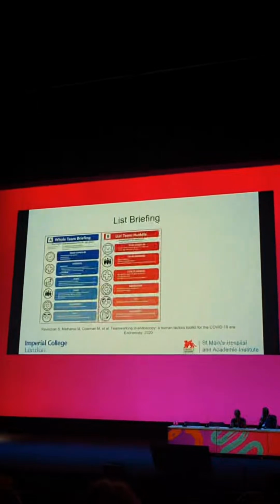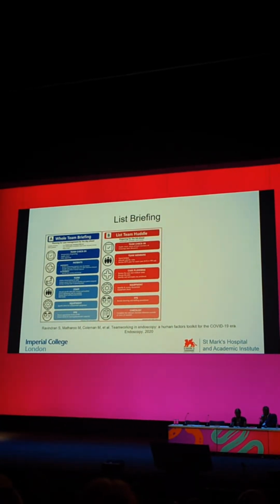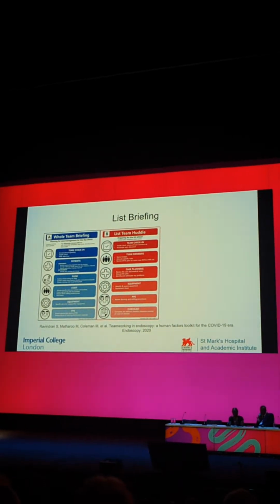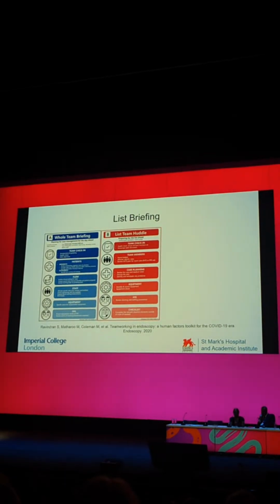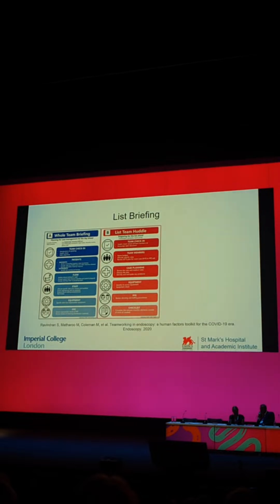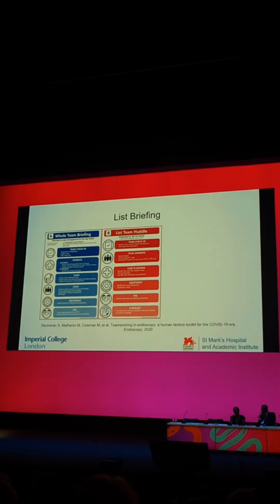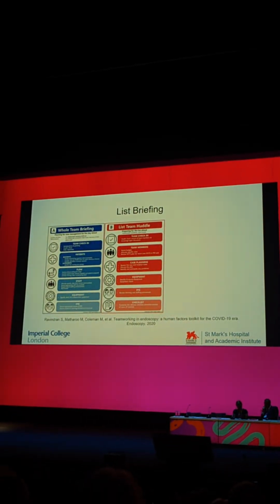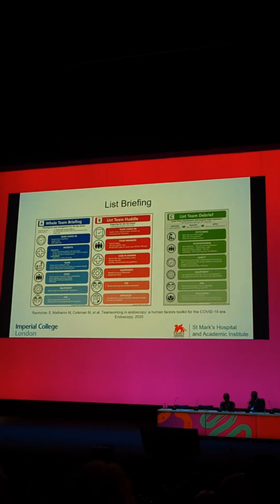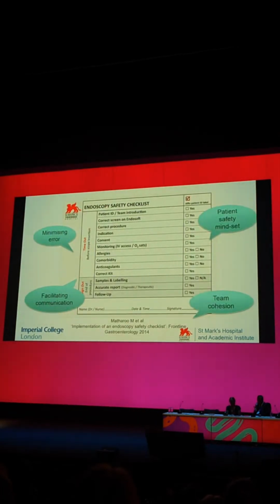You have a whole team huddle at the beginning of the day with your nursing team and your decontamination staff, to see what issues around the unit are. And then you have a team huddle with the people that you're doing the endoscopy list with, so that you can really drill down on the mechanics of the cases, prep the nurses on the kit that you might need, and think about the order of your list to avoid mistakes translating into the room. And to close the loop, there's also a debriefing section that you can employ.